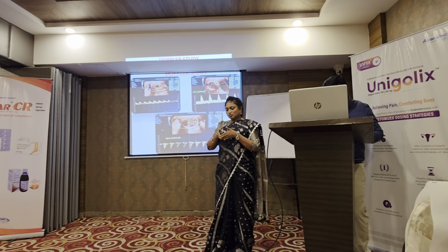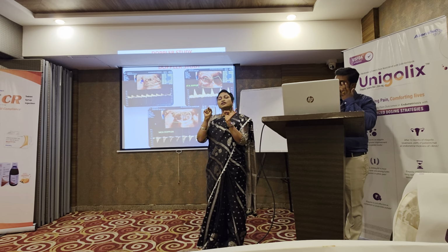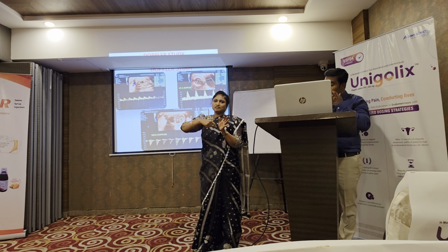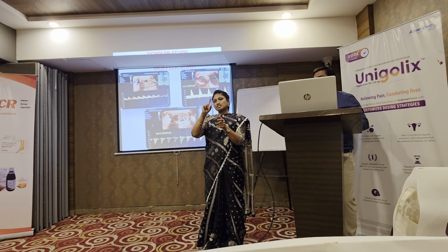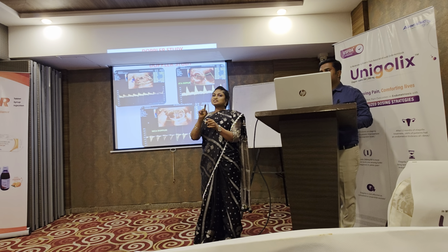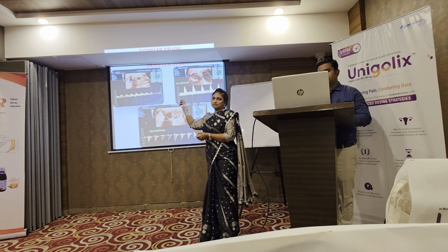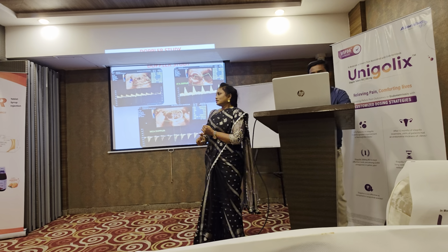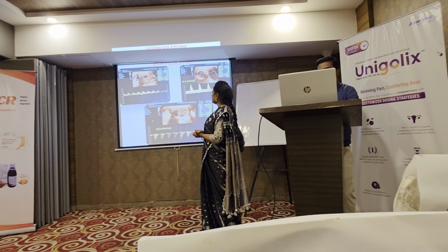Around the bladder, when you see both the umbilical arteries, one on either side, it tells you that it's a 3-vessel cord. If it divides into 2 vesical arteries... if there is only one artery around the bladder, it means it is a single cord, single umbilical artery. So you can do 2 things at one time. You can rule out if it is a 2-vessel cord, as well as you can record the umbilical artery Doppler.